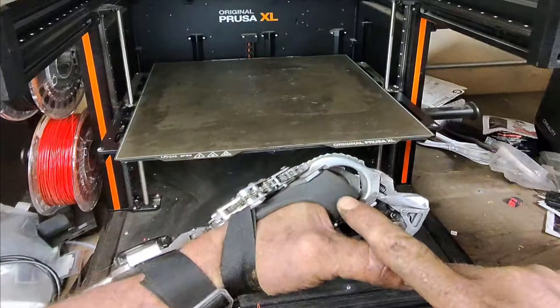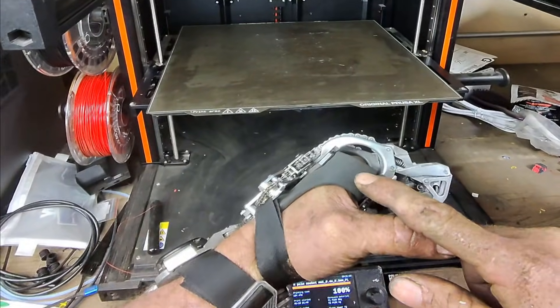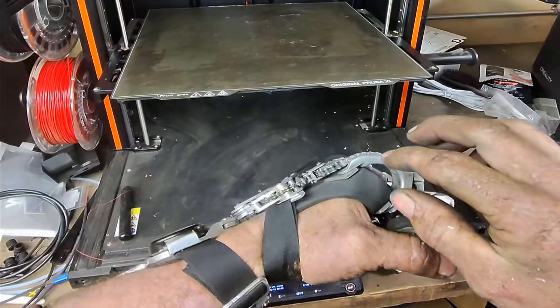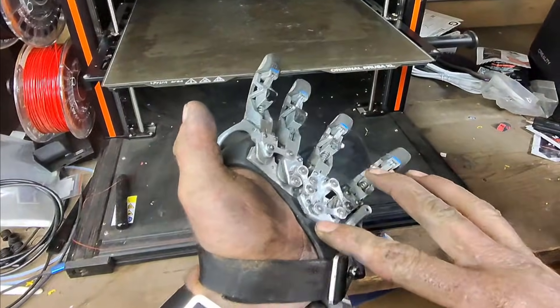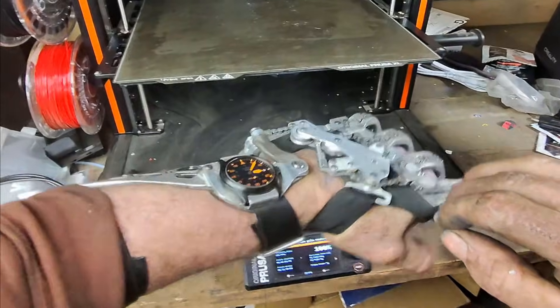On the Prusa XL I printed a dual material socket using ColorFab TPU. The inner red piece I printed at 255 degrees and the black at about 220, so it gives me a different feel.